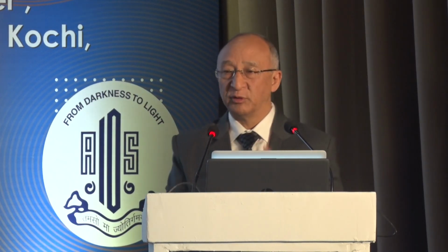So I have talked about two important areas. One is looking for a corneal profile, separating the aberration profile from the total internal aberration profile. Those patients where your corneal profile is good, these are patients you are going to succeed in giving a good outcome for your patient. A patient may have only corneal toricity, so you can do a very nice toric IOL, good implantation and good results.